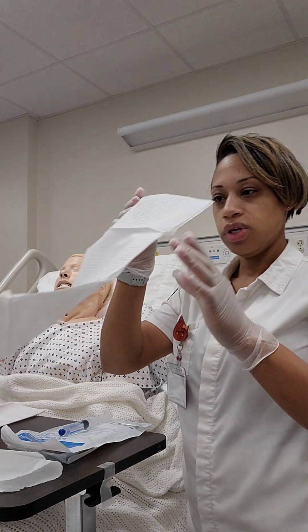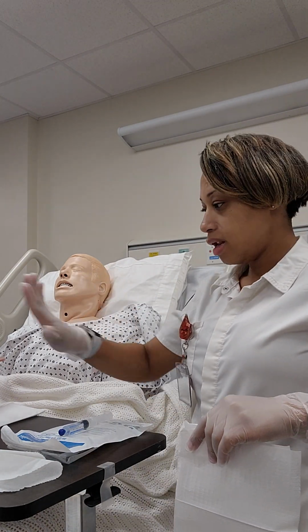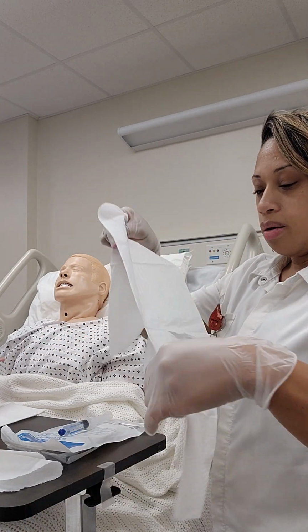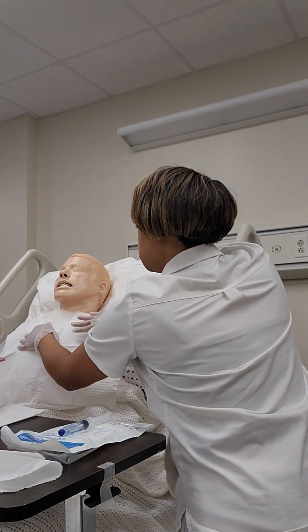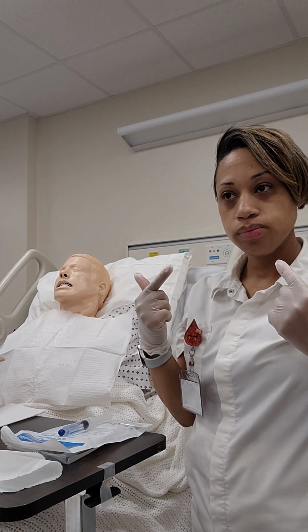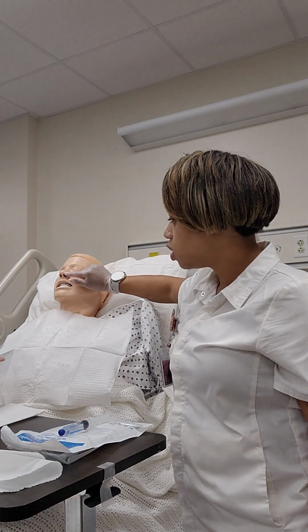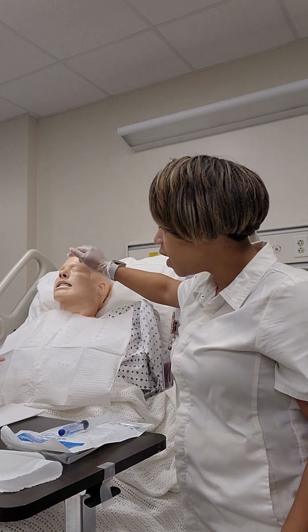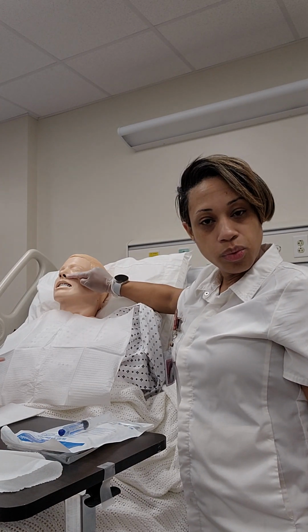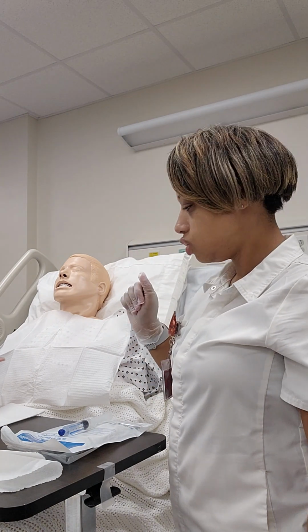The first thing that I'm going to do after assisting my patient to high Fowler's, as long as it's not contraindicated, and I have everything positioned for the patient, is drape the patient with a disposable drape. I'm going to check the nostrils to figure out which nostril I'm going to use. I will occlude one nostril and have the patient breathe in and out on each side. I'm going to say I'm going to use the one closest to me because the patient doesn't have any problems with breathing out of the nostrils.